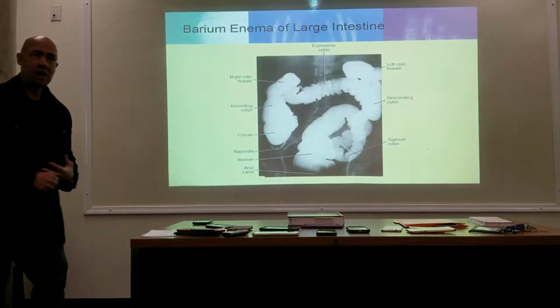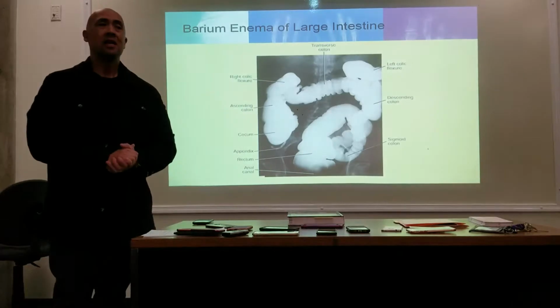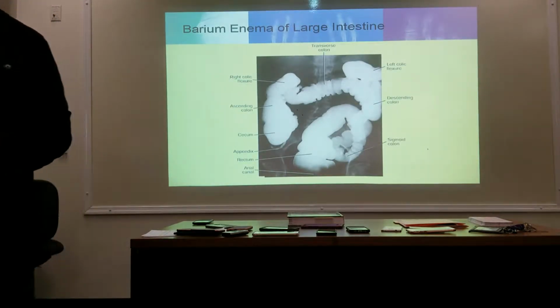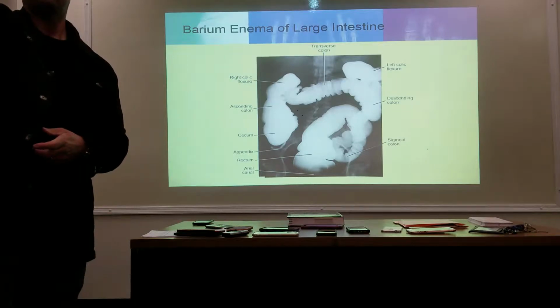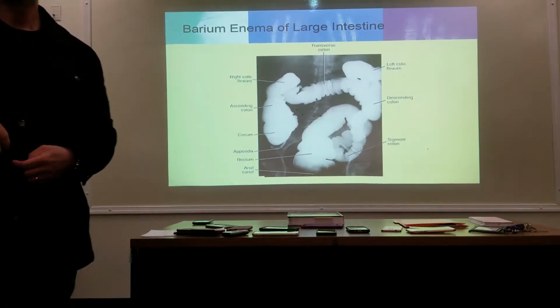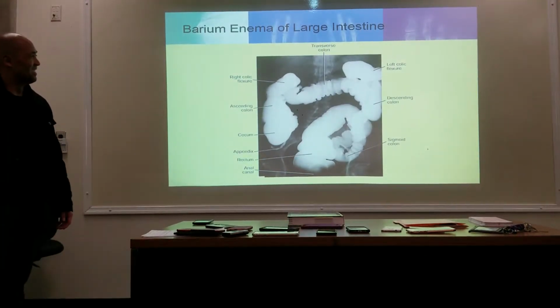So, how many of you have seen a barium enema? Okay, just a few of you. Now, each time they perform the enema study, they also instill air in the colon. After every shot. How about someone raise their hand back there? Also with air? Do you remember? I'm not sure. You don't remember? Okay, just like you were in shock, right? I don't remember anything. Still in shock.